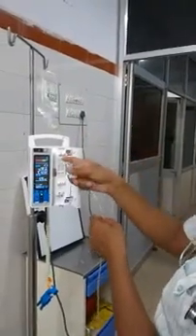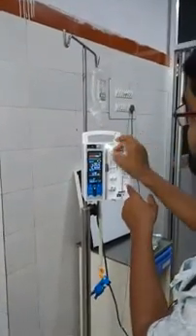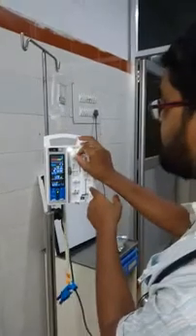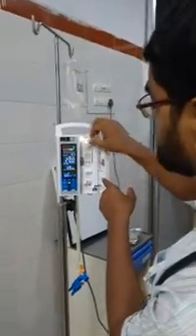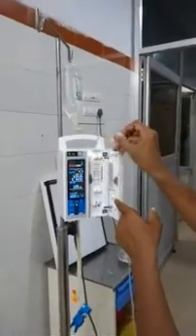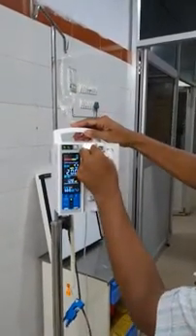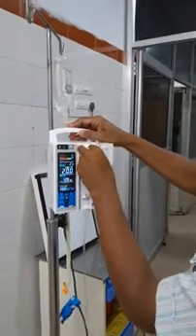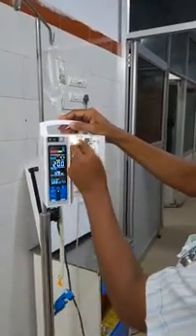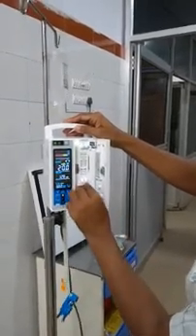Now the air sensor which is there here needs to be thoroughly cleaned. That is a very important thing. If that is not maintained, or if there is dirt over here, there is every chance that even in spite of no air bubbles, the machine will detect air bubbles. So it needs to be cleaned nicely, which I am doing, and at the same time I can also clean the pressure sensor.